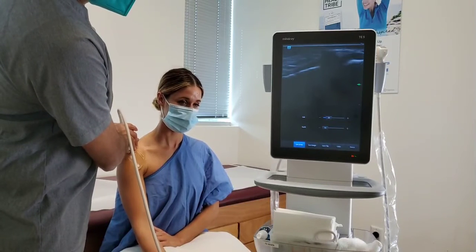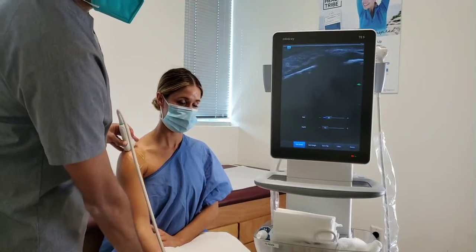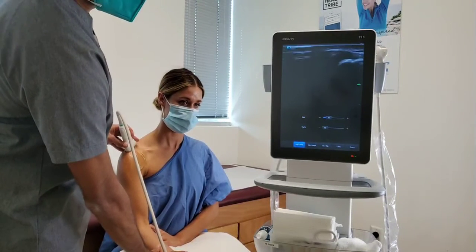So again, here's the AC joint. And if you could move your arm for me, you can see how there's a little bit of motion that takes place there.